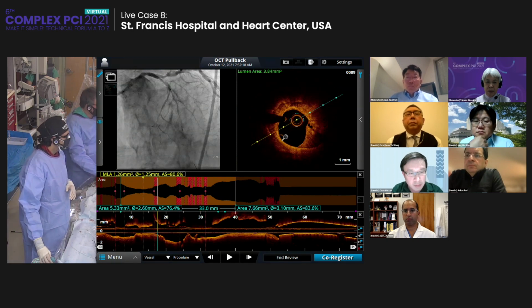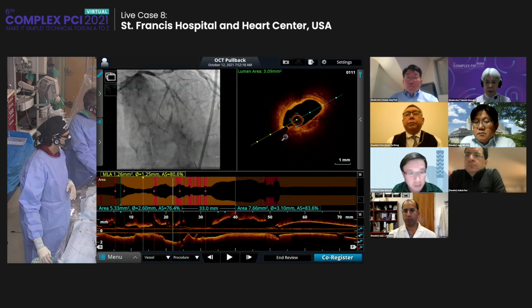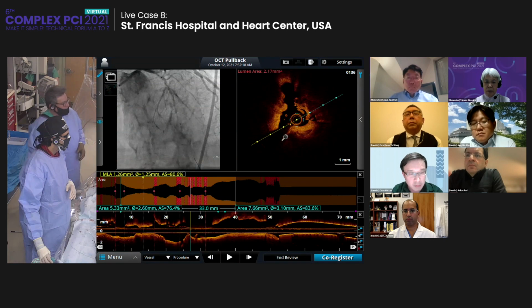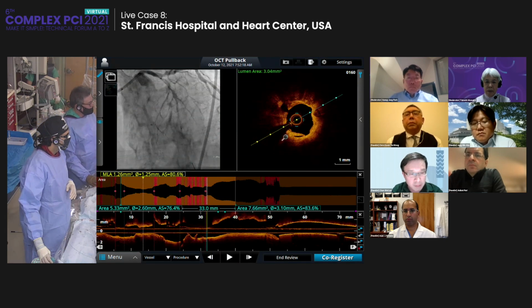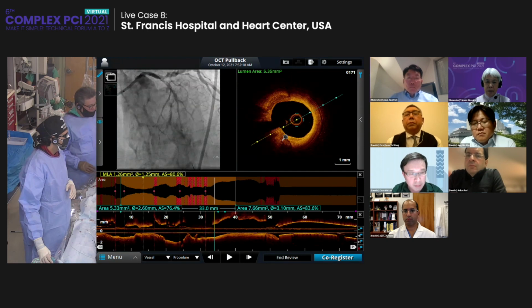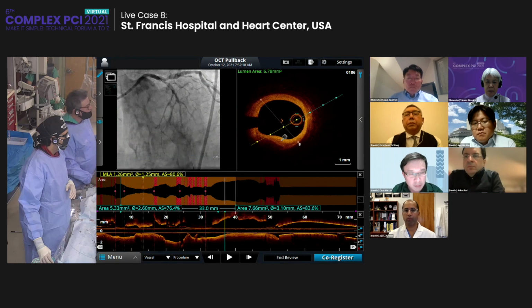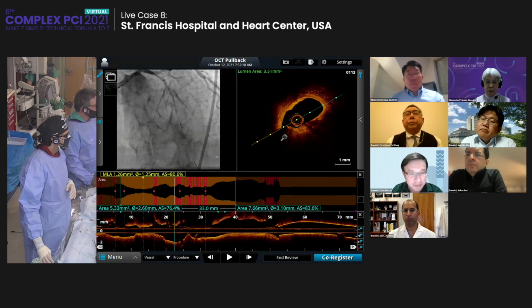So first of all, one nice thing about Shockwave is that even though we may have created some fracture to the vessel, we can go ahead and shock this calcified area that wasn't fractured to get our best expansion. We also, if we had a bifurcation lesion or left main, we could wire both vessels, and angulated segments are not a problem. We use a lot of CSI, a lot of rotablator, but this is an ideal case with the angulation for Shockwave.